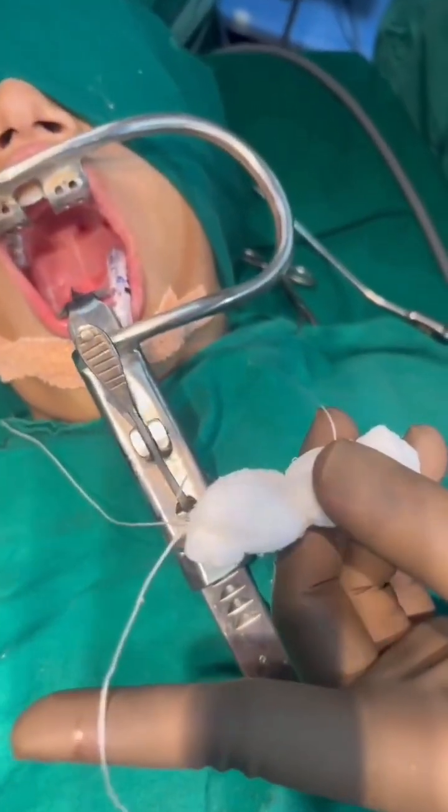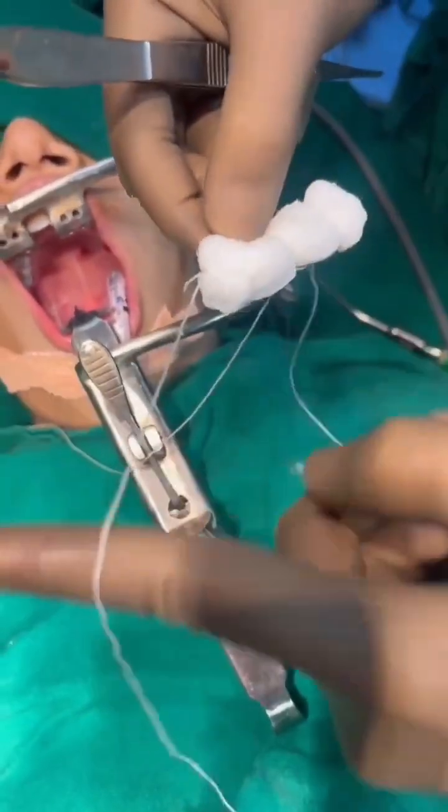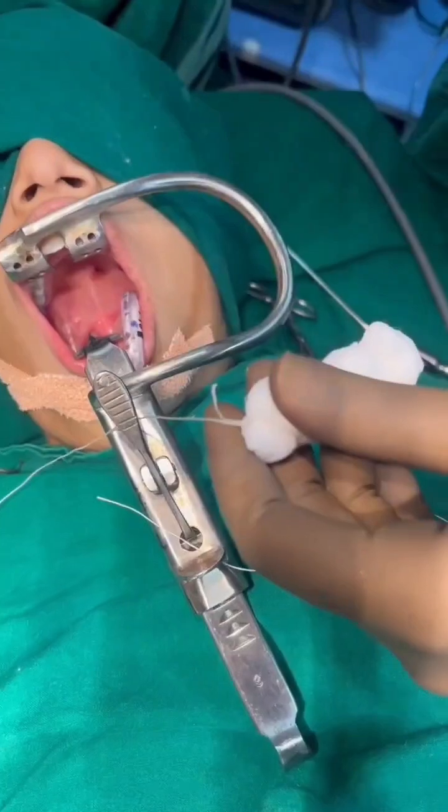This bolster should go in the nasopharynx with two threads: the two side threads coming out of the nose, and the single thread will be out of the mouth. To process this, we will pass two infant feeding tubes from each nostril.